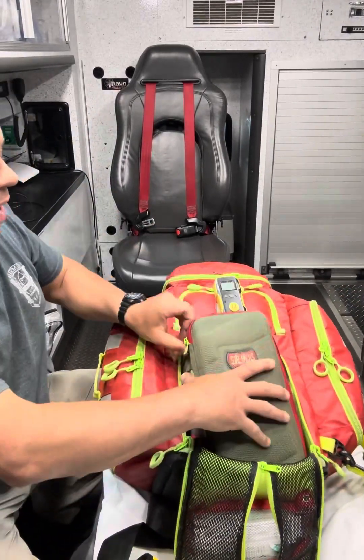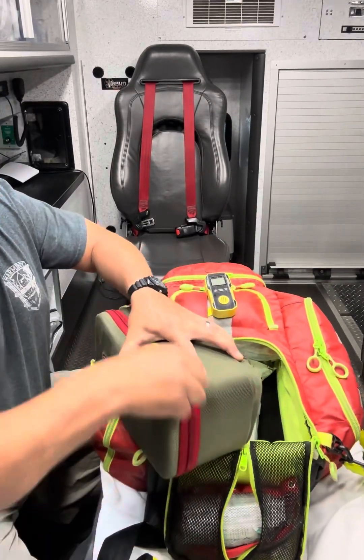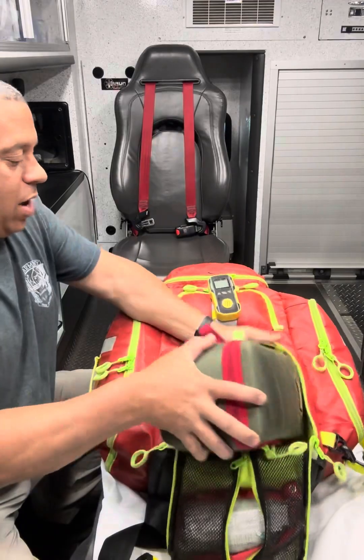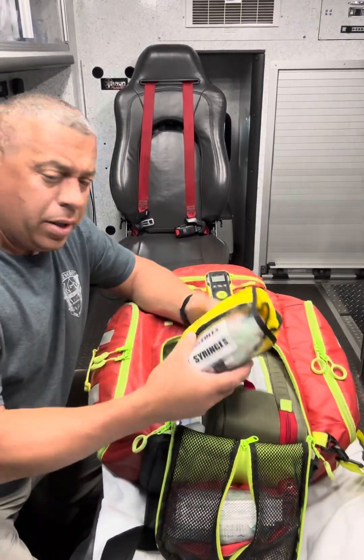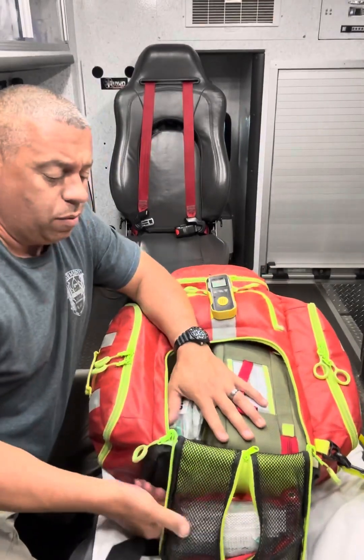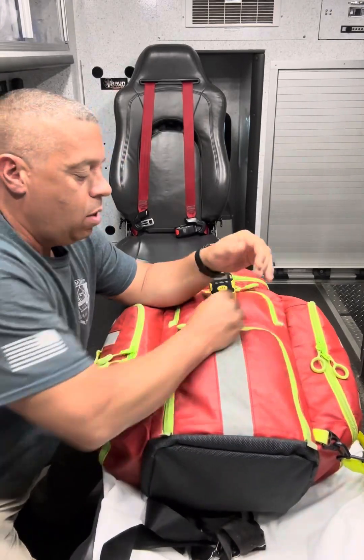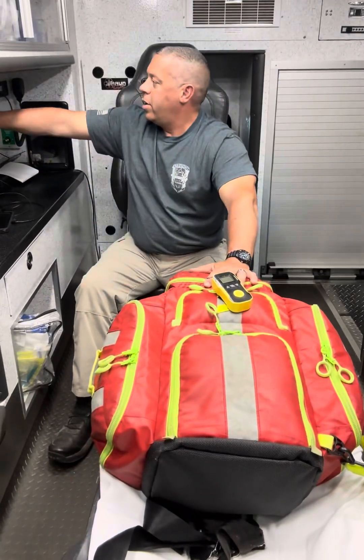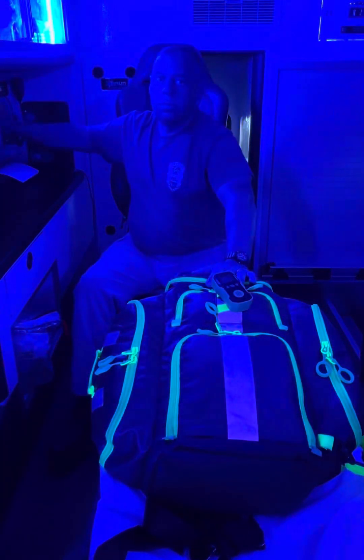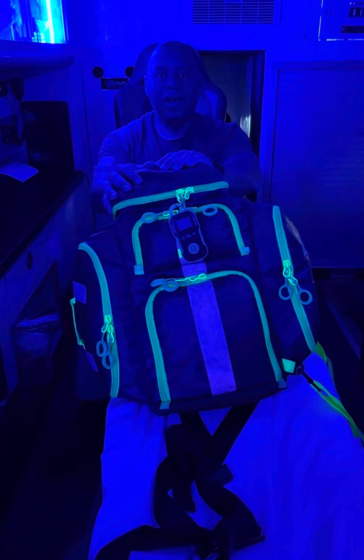So that's our bag. The bag can be worn as a backpack, so there's axial loading in the center of your spine as you're carrying it. Sometimes we have to carry it into a house, and other times into a wooded area or somewhere remote, so that helps us as well. We also have red and yellow reflective material on the bag. If you have any questions, let us know.